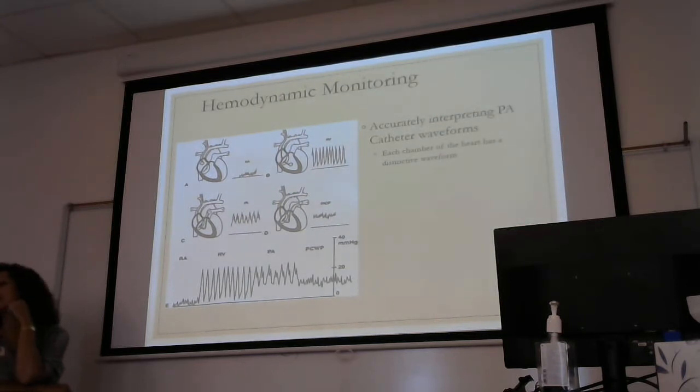Why can I not put a catheter back inside the human body that has slipped out partially? It's contaminated, that's right. So can a doctor advance this catheter once it's been pulled partly out? The answer is no. It has to come out. Okay? But you have to call and let them know what's going on. That's your responsibility to monitor that waveform and know what it should look like. Everybody okay so far?